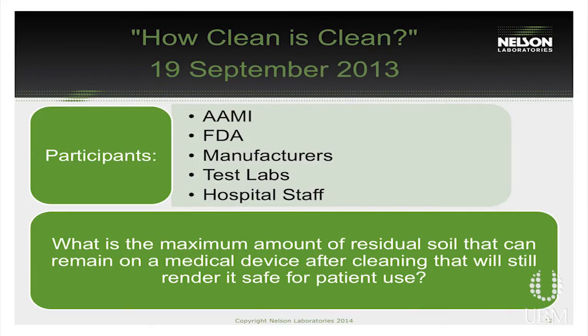So I was honored to facilitate a roundtable discussion on how clean is clean. We had attendees there from AAMI staff, FDA staff, medical device manufacturers, testing labs, and also hospital staff. So we had a really great conglomerate of people. And the big question that we tried to answer, and we're still working on that answer, is how clean is clean? So really, what is the maximum amount of residual soil that can remain on a medical device and still be safe for medical use or safe for patient use?